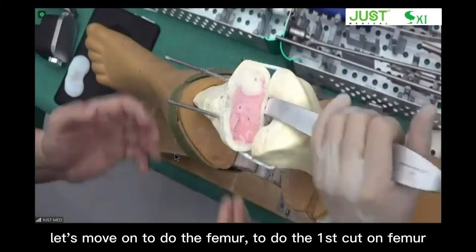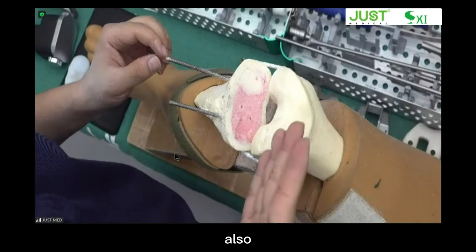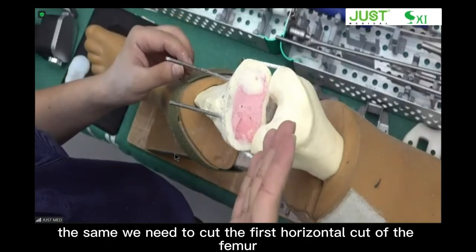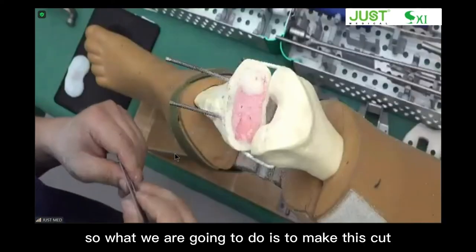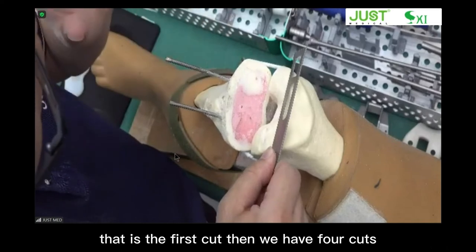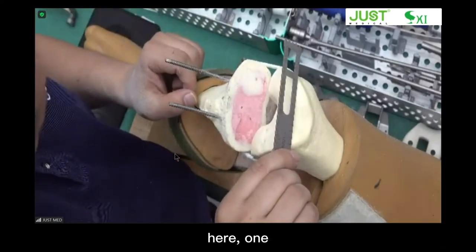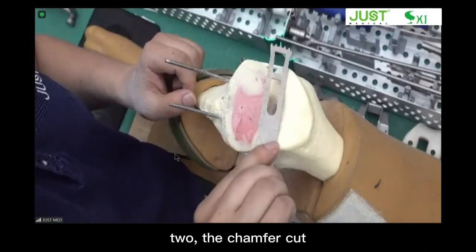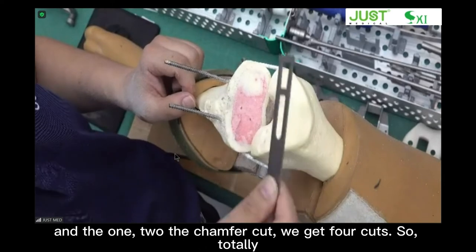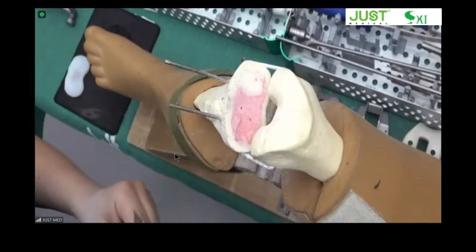Let's move on to do the femur, to do the first cut for the femur. Also, the same, we need to cut the first horizontal cut of the femur. So what we are going to do is to make this cut. That is the first cut. Then we have four cuts. Here, one, two, the chamfer cut. And then one, two, the chamfer cut. We get four cuts. So totally, we're going to make five cuts. So first the cut, let's do it.